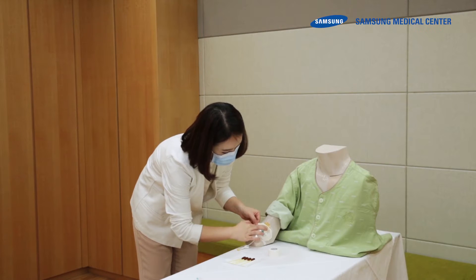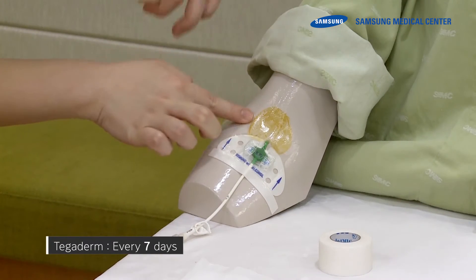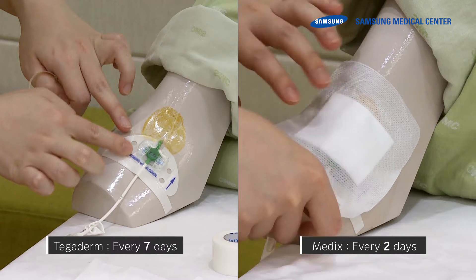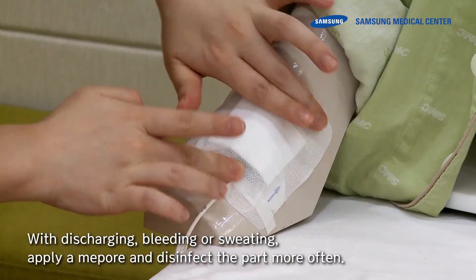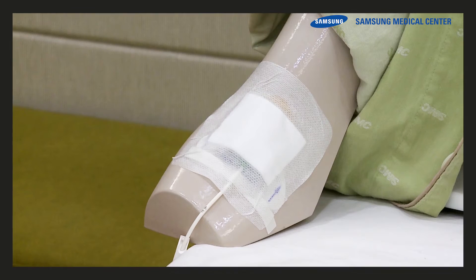When a Tegaderm is applied on the insertion site, it is disinfected every seven days. When Mepore is applied, the insertion site is disinfected every two days. With discharging, bleeding, or sweating, apply a Mepore and disinfect the site more often.